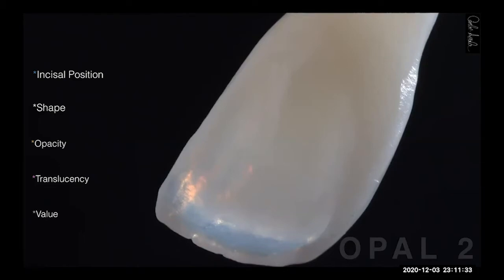And value, why value? Because normally we technicians love to use too much enamels, too much opals, too much translucency. And sometimes we change the value, because we can control that sometimes. And sometimes we don't think that the concavity of the mouth is dark. So sometimes we see nice crowns on the model, but when we go to the mouth, everything looks grayish. It's because we use too much translucency, too much enamels. So one of the ways to control the value of the restoration is doing that technique, okay?